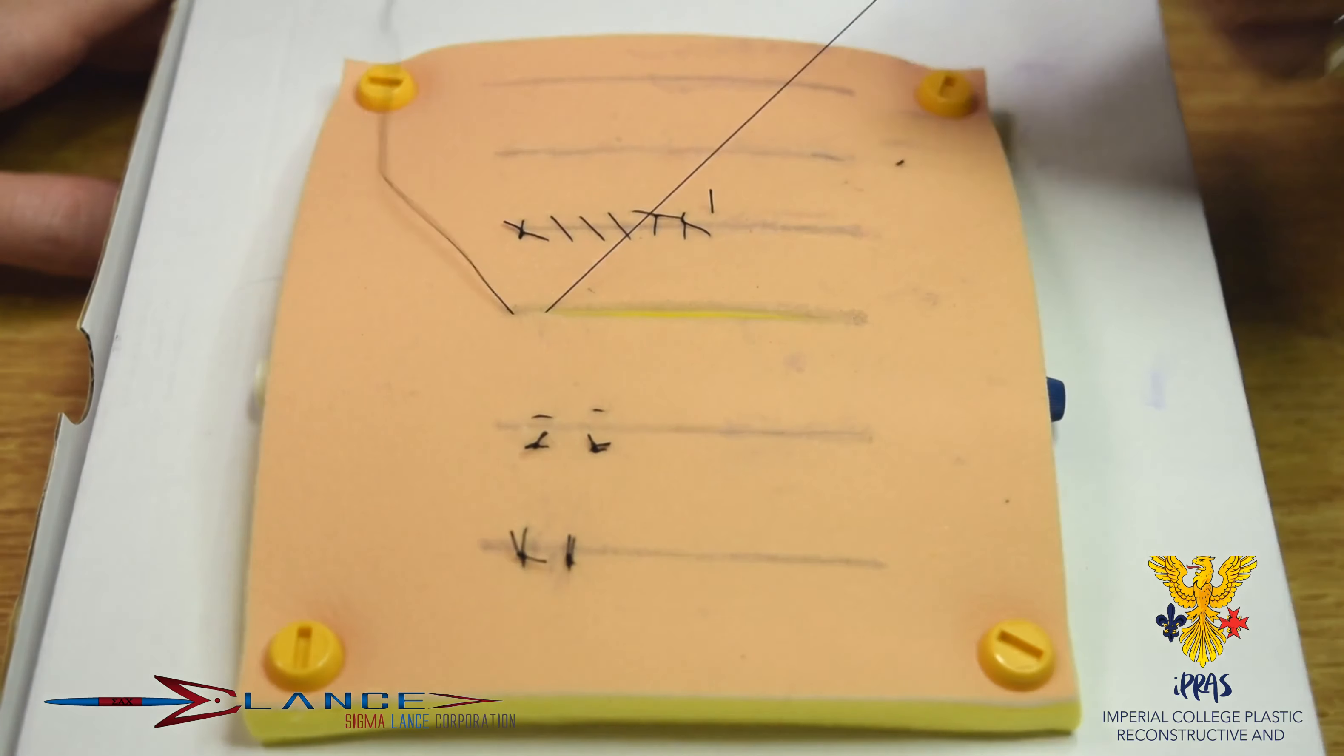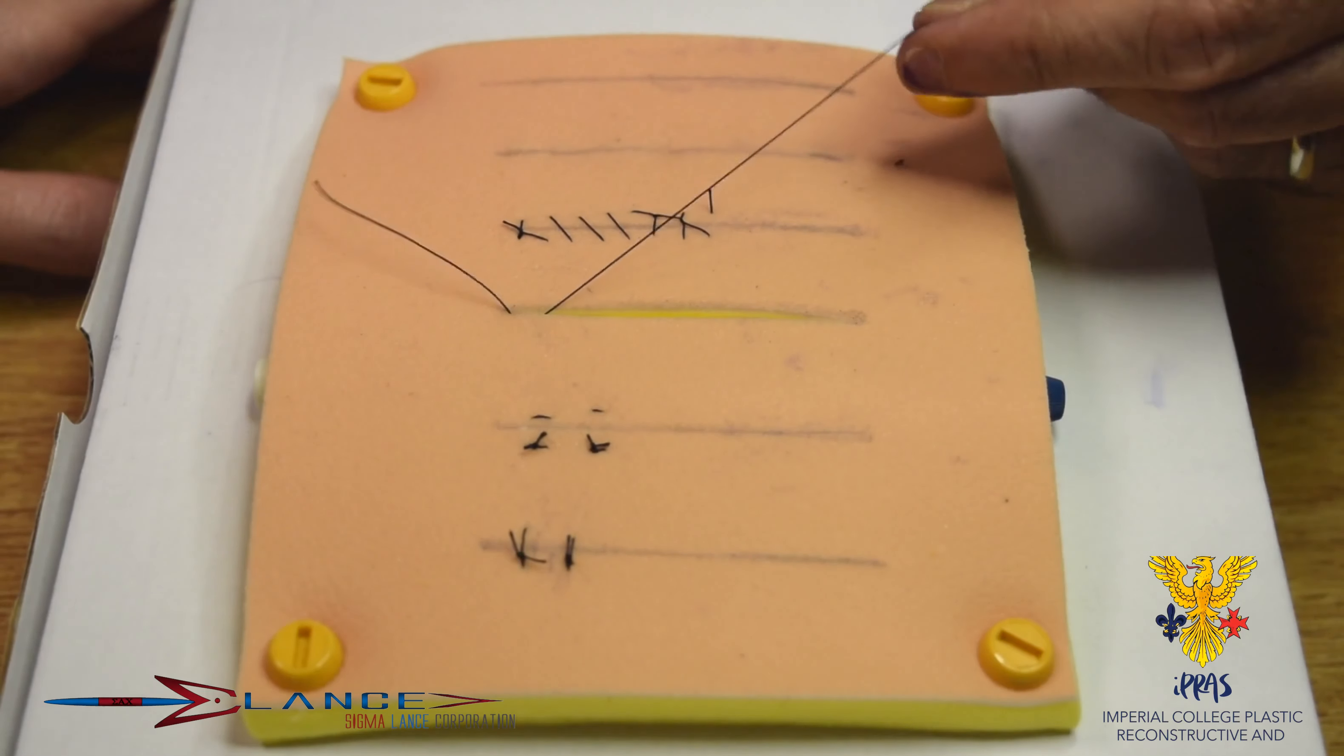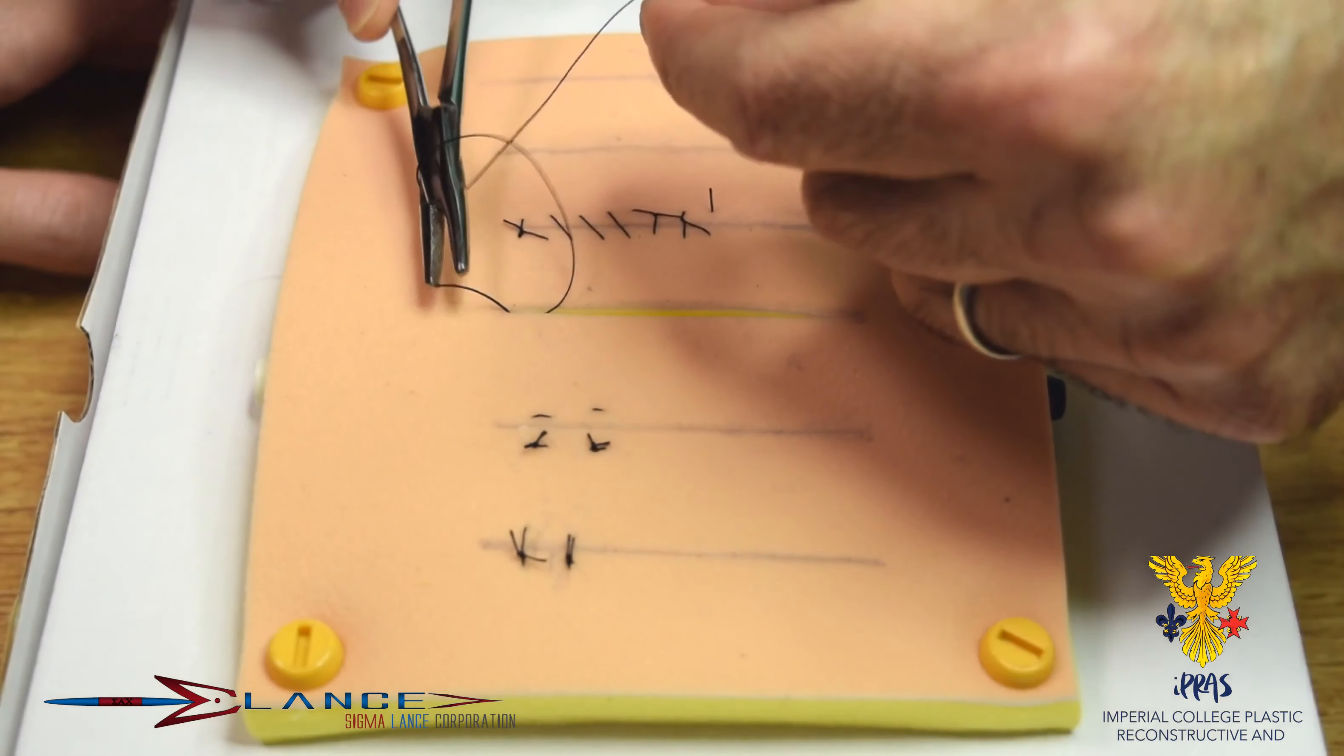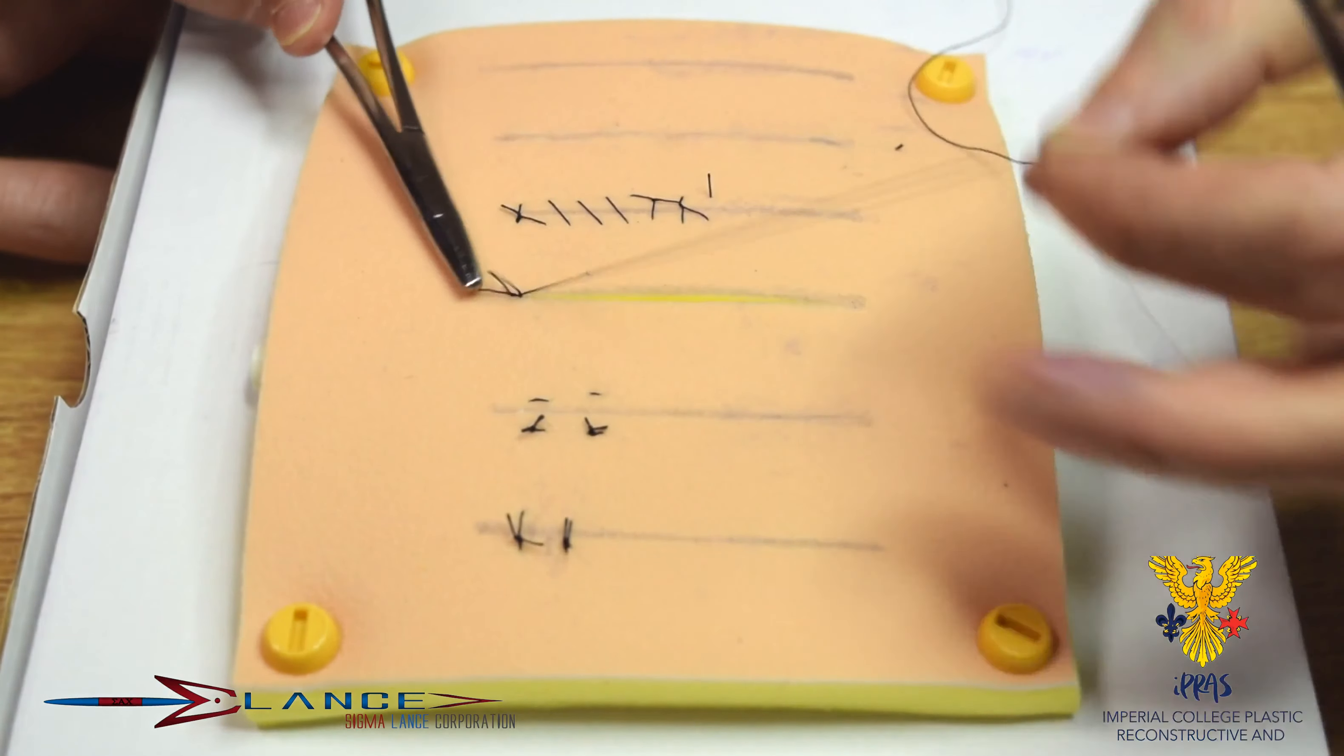And again, don't worry, this is slightly more difficult than real life because the dermis would ordinarily be much thicker than that. So it's much easier to grab that white dermis, but you should try and get in that plane. We just put a single knot in there so there's not too much knot material at the end.